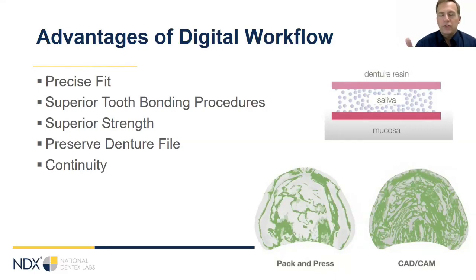As we mentioned, digital dentures are cured in 50 micron sections, so they can have a near perfect fit, which is really nice. And it's intrinsic to the process. You design it to fit to the model and you print it with a good printer, it just happens.